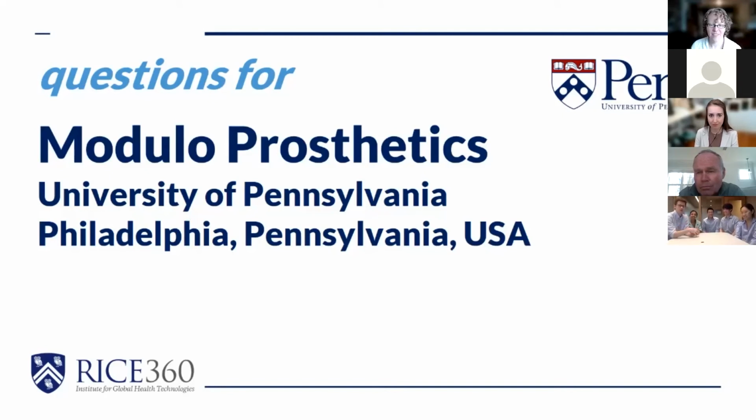20 newtons. Sorry about that. Up to 20 newtons, though the durability of the device can take much more force. We did some testing with a simulation. We applied 10 pounds of force across the thumb tip, just for the 3D printed nature of it, and it would not break in those settings. So we know where they're pinching it in that regard. But the actual force sensor itself can get to 20 newtons.